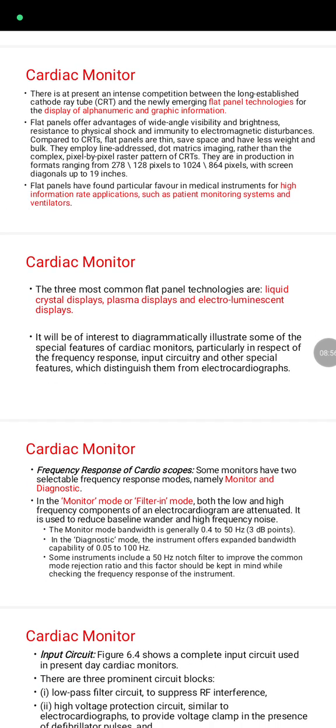The three most common flat panel technologies in cardiac monitors are liquid crystal display, plasma display and electroluminescent display.